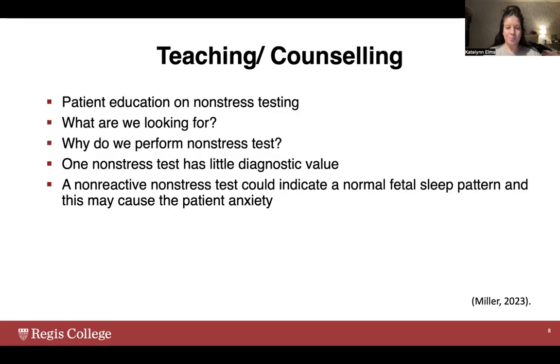Patient education. If they're interested in learning, definitely educating them. Some people get very triggered by listening to the sound. So I always discuss with patients if they're anxious, if they want me to turn the sound off, and explain to them what I'm watching for, what I'm doing, and if something was wrong and I came in quickly and asked them to turn, they need to move quickly.